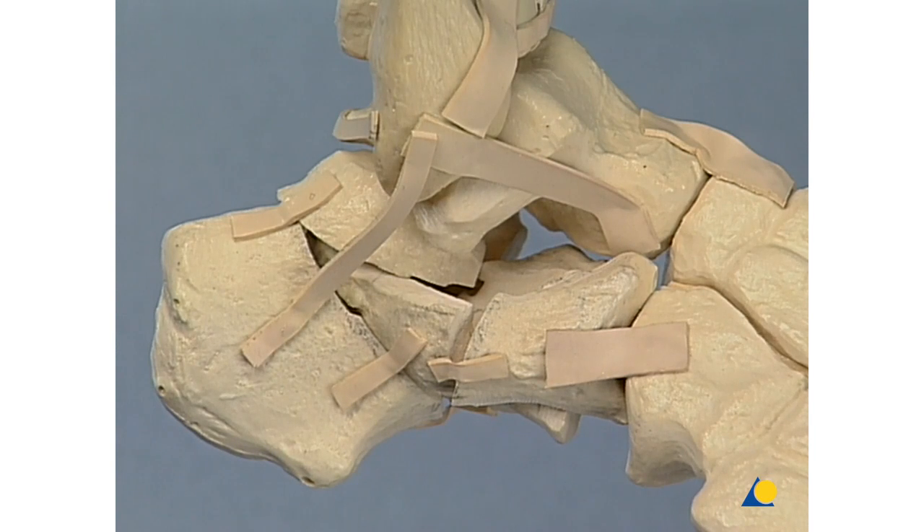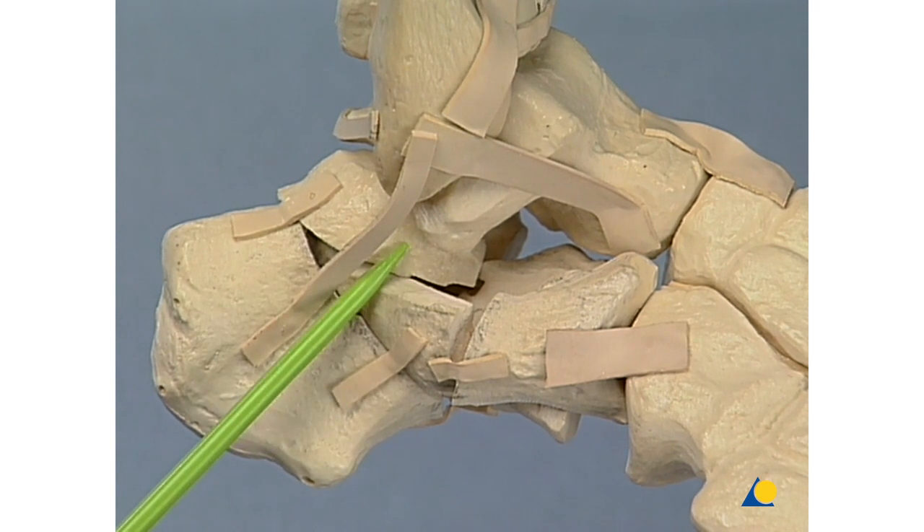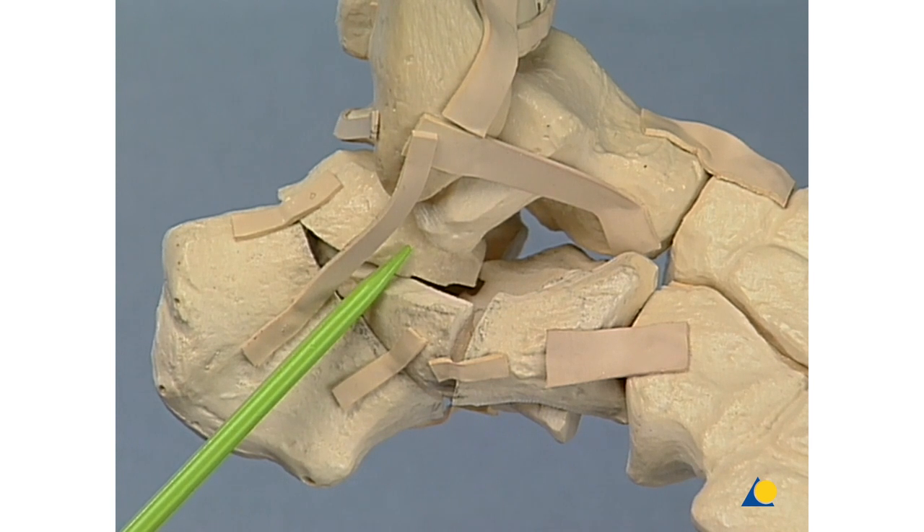In this exercise, we are performing the open reduction and fixation of a comminuted fracture of the calcaneus, comprising six displaced fragments, four of which have a joint-bearing function. The first is an extra-articular fragment of the greater tuberosity of the calcaneus. The second is an extra-articular lateral fragment of the wall of the calcaneus. The third is a joint-bearing fragment of the posterior facet of the calcaneus.